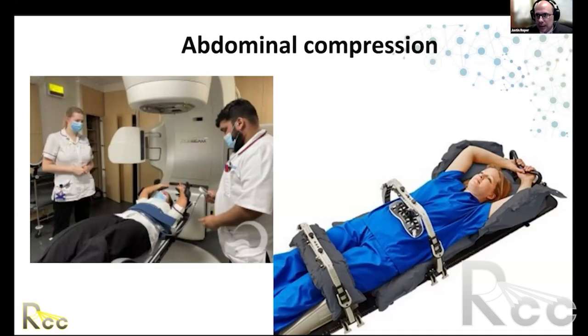There are instances, however, where abdominal compression, despite however well it may restrict the surface motion, does not provide adequate restriction of the internal anatomy. Next slide, please.